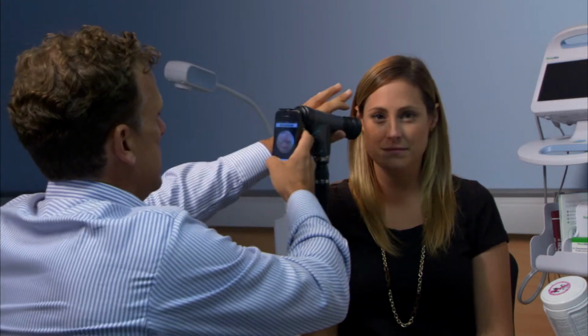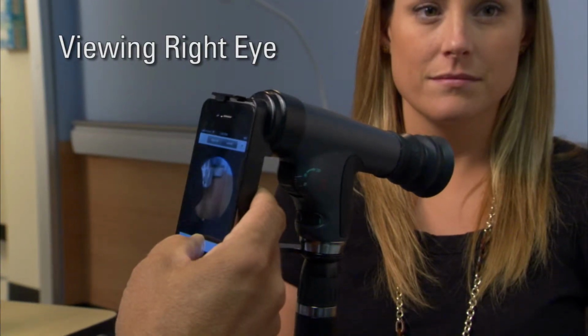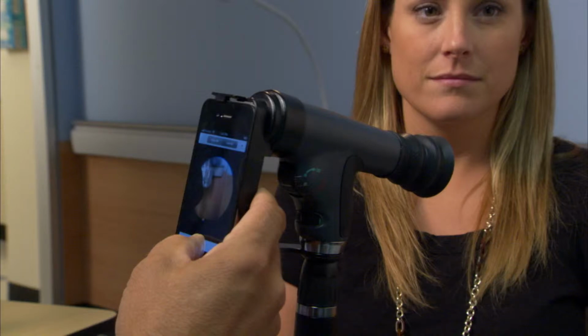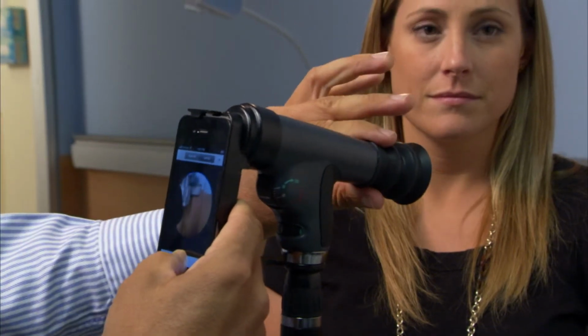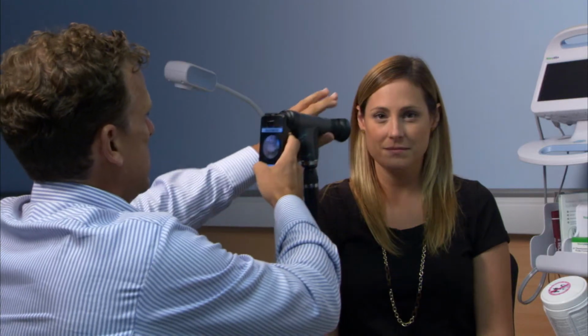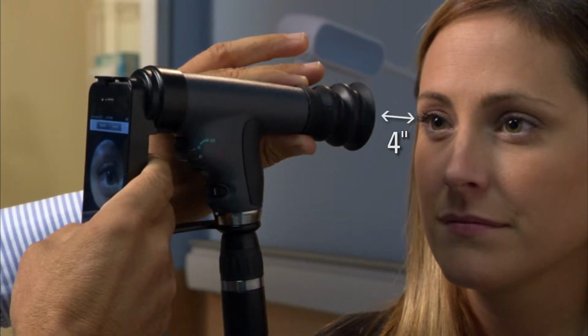For best results, use the device in a dimly lit room and try to have the patient looking towards a dark or shaded area of the room. For viewing the patient's right eye, grasp the support arm between your index and middle finger of your right hand and use your thumb to touch and hold the camera button on the iPhone screen. Don't remove your thumb until you're ready to take images. With your left hand, grasp the end of the scope nearest the patient eye cup between your thumb and index finger. Sit opposite the patient and hold the panoptic approximately 4 inches away from the patient.